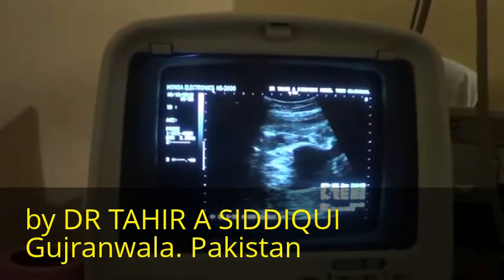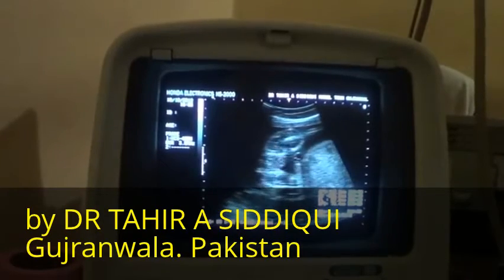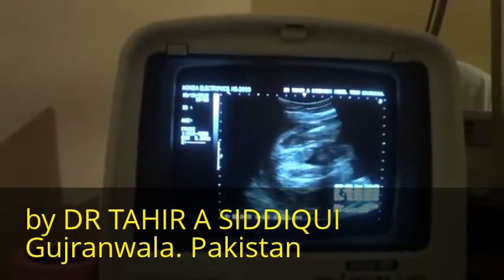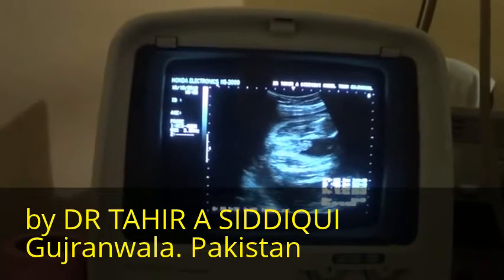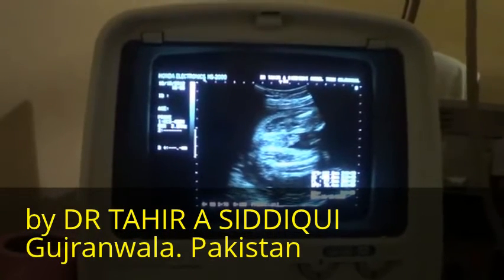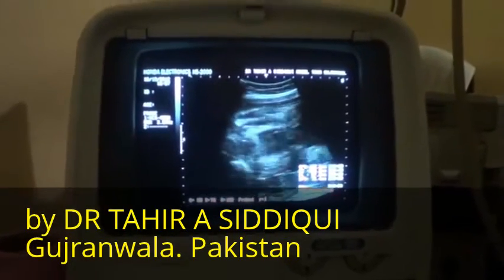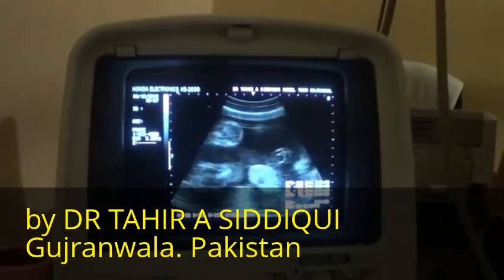Here we see scrotum with testis, scrotum with penis. You can see that the fetus is very active. Now these are the thighs, this is the femur thigh, and this is the scrotum, this is the penis. So a male fetus, the bones are normally calcified. There is no curve seen relating to the bones.